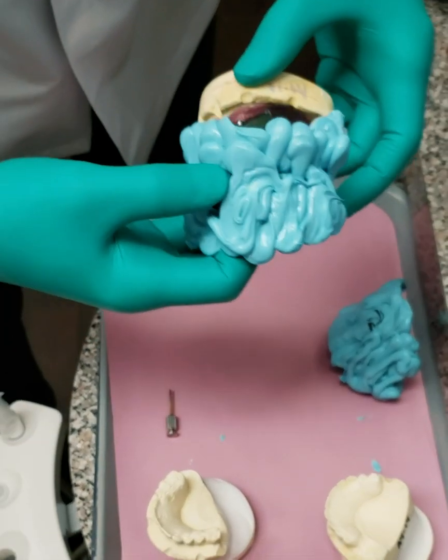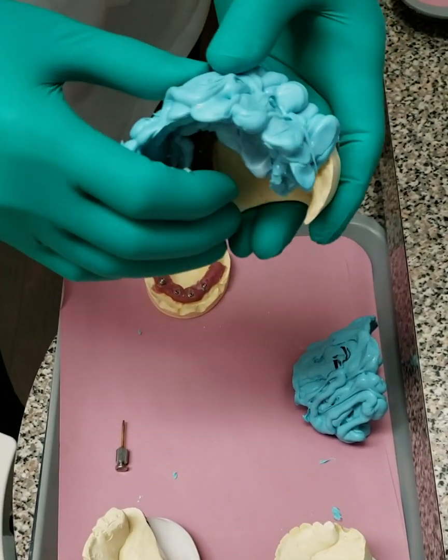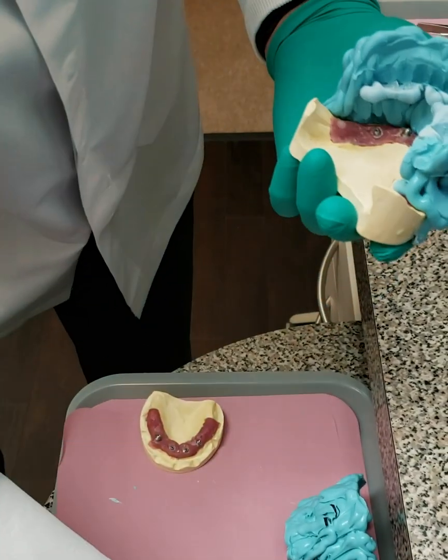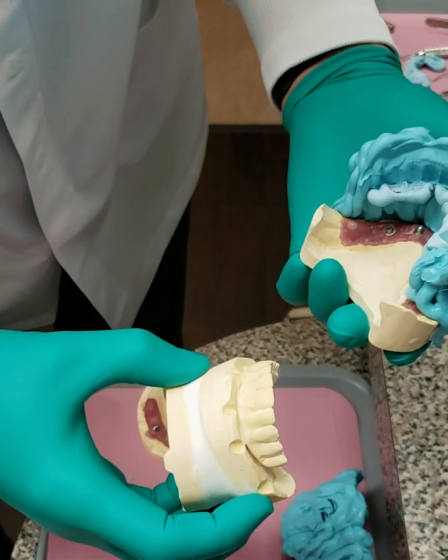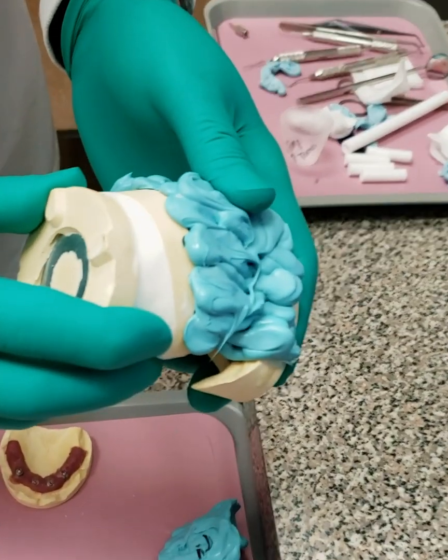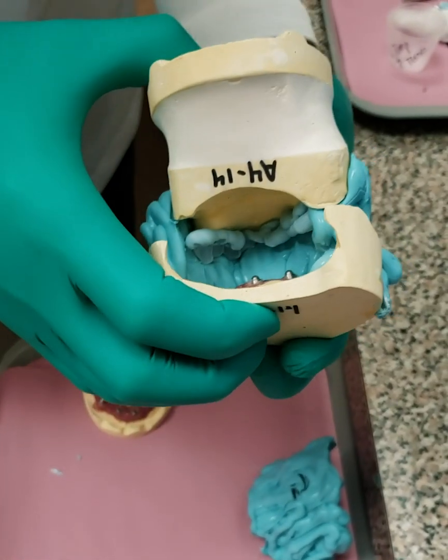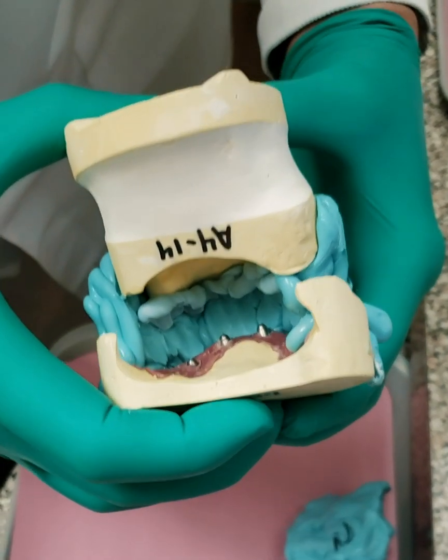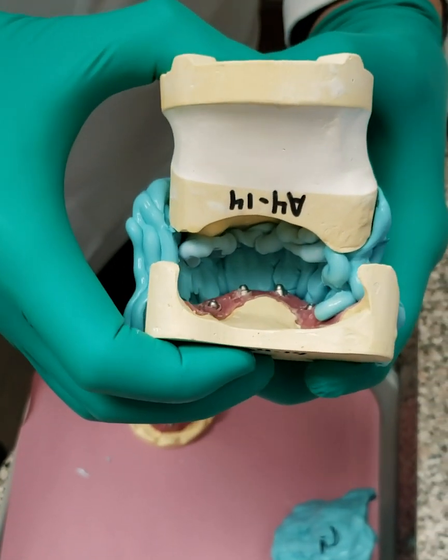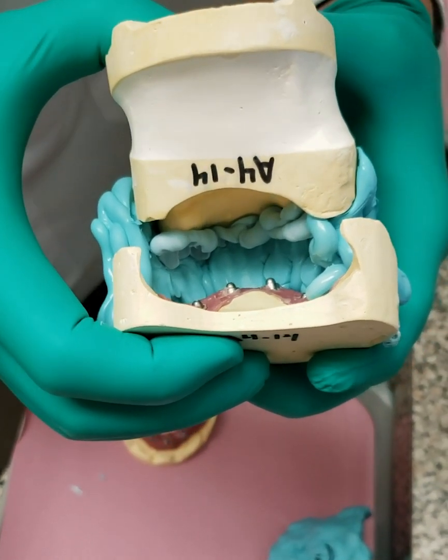In order to check our work, what we do is take the bite, put it back on. Now this would be the first if it was just a single. And then we take the upper model, and the upper model should just lock in as it does. And this is what the laboratory sees, and this is exactly the vertical of what the patient had in the patient's mouth, the vertical in the bite.